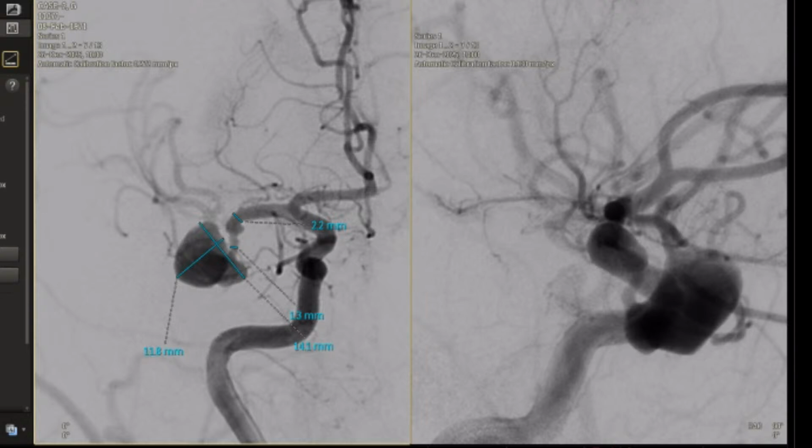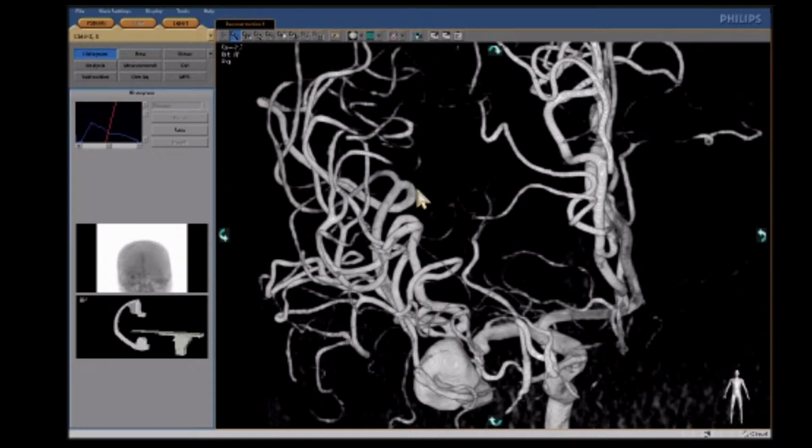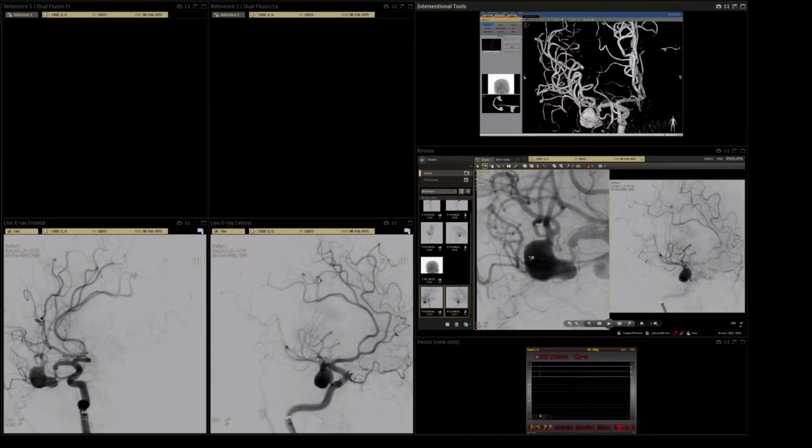Might be from here. And there is a trifurcation. Yes, Davlet sees the similarity with the gastrointestinal tract. It's like a gastro. Okay.